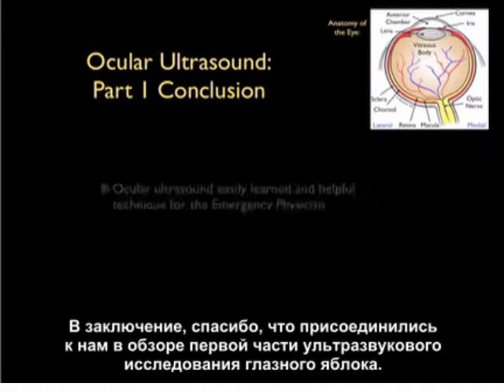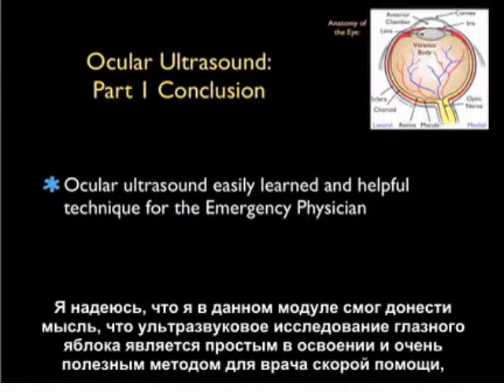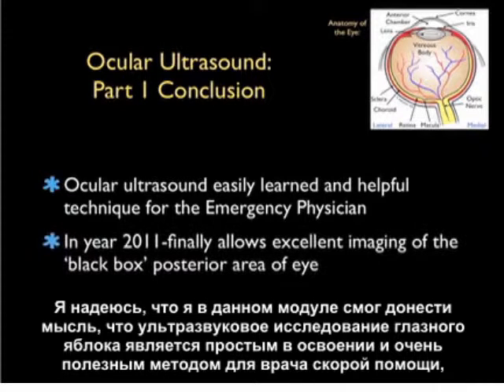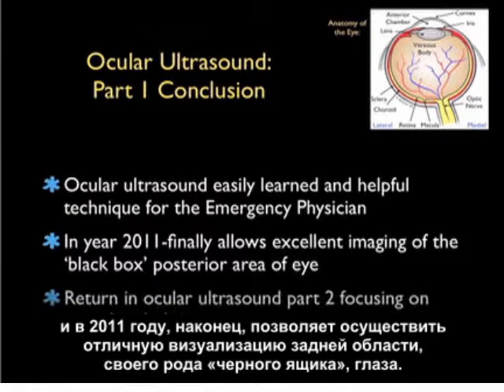In conclusion, thanks for tuning in to part 1 of ocular ultrasound. I hope I've been able to get the point across through this module that ocular ultrasound is an easily learned and very helpful technique for the emergency physician, and in the year 2011 finally allows excellent imaging of that black box posterior area of the eye.